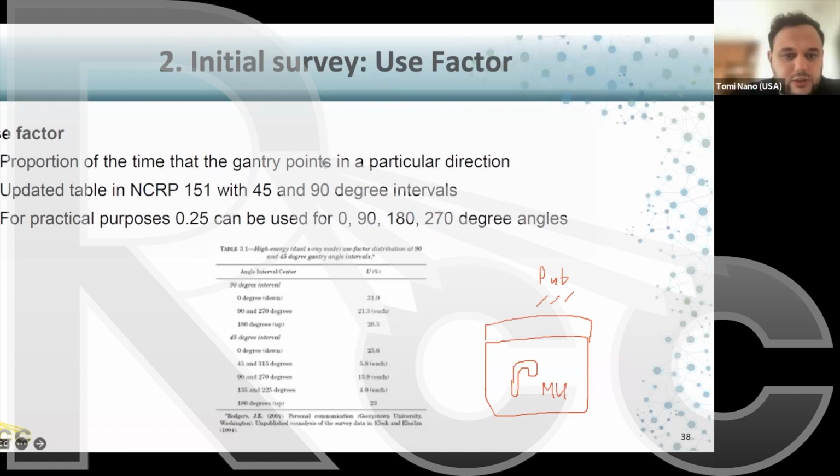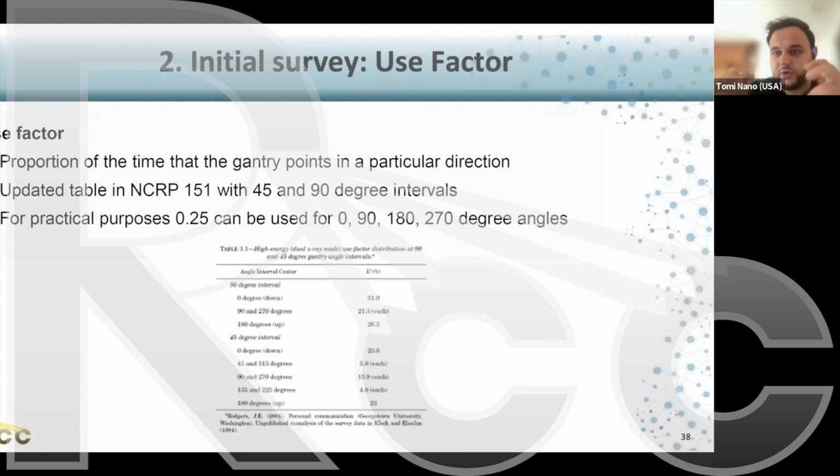Yeah, and I was looking at the chat and noticed somebody was wondering why IMRT uses more MUs than 3D conformal. The reason is that you're sculpting the dose, so the dose is delivered in smaller fragments. Each time you deliver a fragment or a control point, you're delivering MUs. So if you had an open cutout, that single MU would send dose through the entire area.